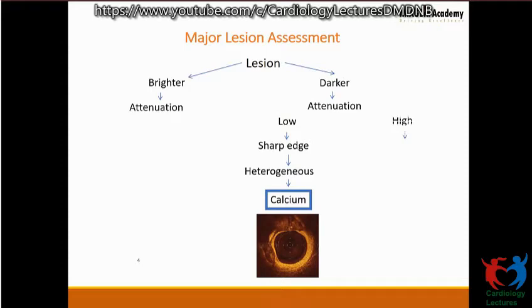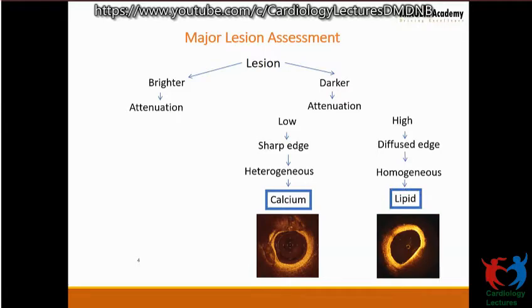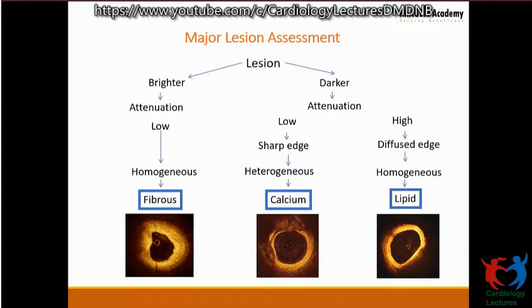It really looks beautiful. But in case you have very high attenuation, that means the light which is going through is not getting reflected back, it is completely absorbed. There will be no edges of the plaque, and it appears homogeneous. It's a dark patch, and then you are dealing with a lipid plaque. You can see between 3 o'clock and 6 o'clock position in the slide, what is depicted is a lipid plaque. If the attenuation is very low, that means the light is getting completely reflected back and it is absolutely homogeneous, then you're dealing with a fibrous plaque. The fibrous plaque reflects all the light back and appears really bright.